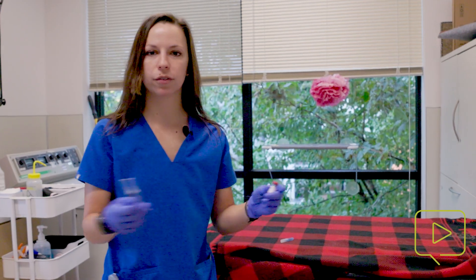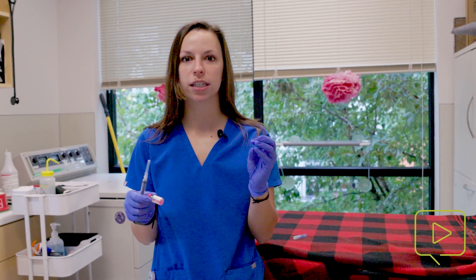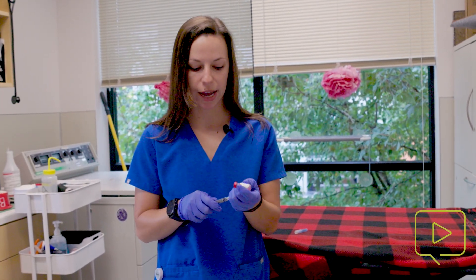Hi, I'm Dr. Ann Marshall, and today we're going to be administering a rabies vaccination to a feline. The first step in this process is that we have to draw up our vaccination. Most of our rabies vaccinations here in the United States come in single-dose vials that are about one milliliter, and that's what we have right now.